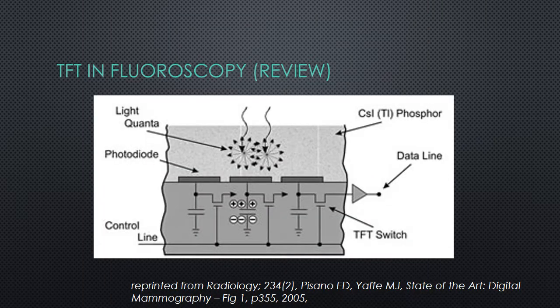So the TFT is an array of electronic components that are layered onto, again, a glass base. And this array includes a readout, a charge collector, and other light-sensitive elements. This is configured within a network of pixels, or more accurately, they're called detector elements, or DELs. And then all of this is covered by a scintillator glass plate.